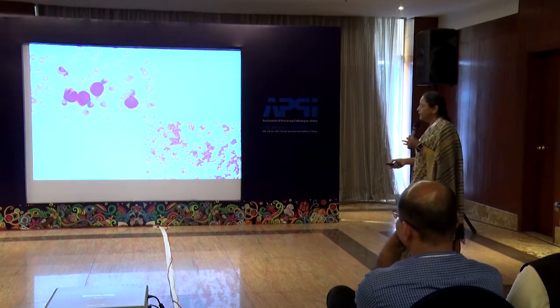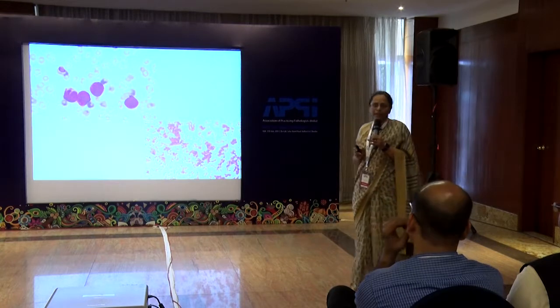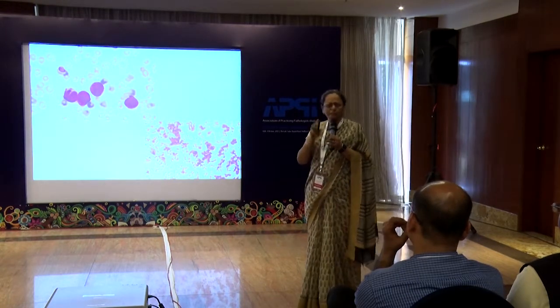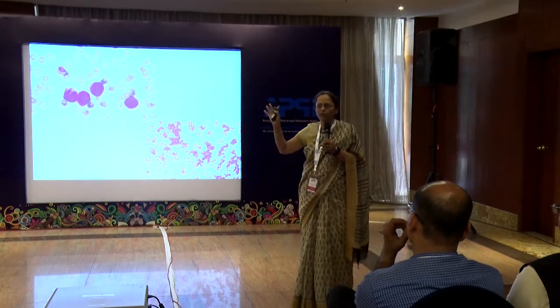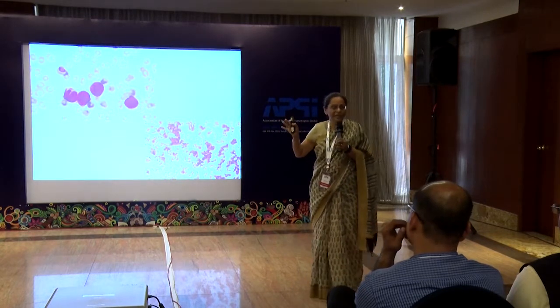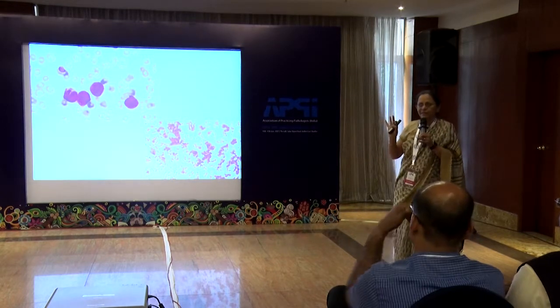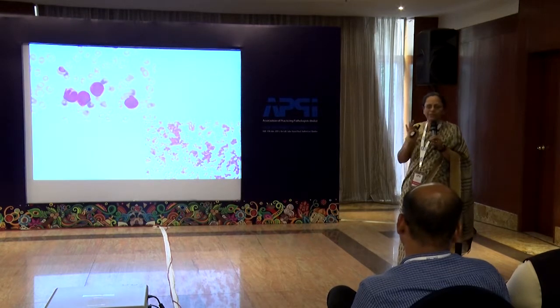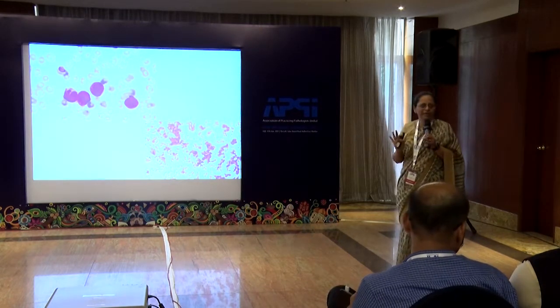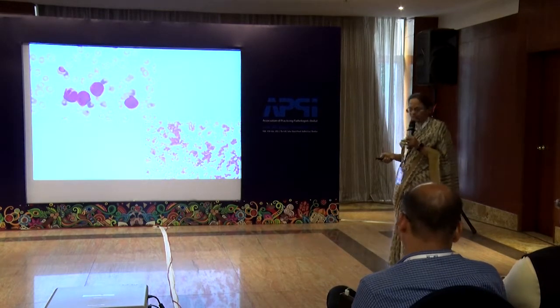And coming to another such diagnosis, this is APML. If you've seen promyelocytes, just keep seeing as many promyelocytes as you can. Now you have access to Google Images. Look at the variety of abnormal promyelocytes that can be seen, and don't miss it, because APML is a good leukemia. It's a leukemia that can be cured. So we shouldn't come between a patient and his cure. We should pick it up as soon as we can, so becoming familiar with these images is very important.